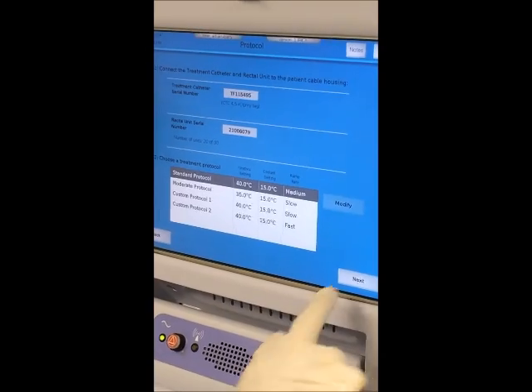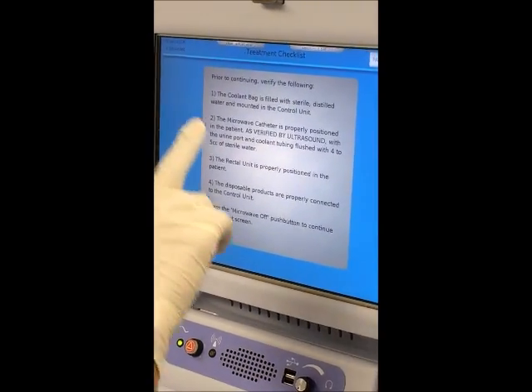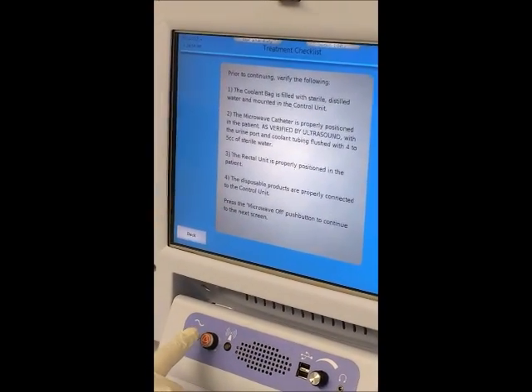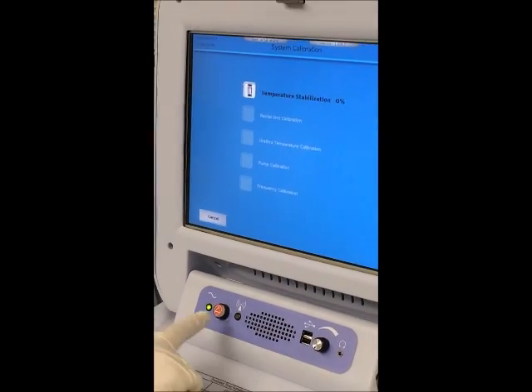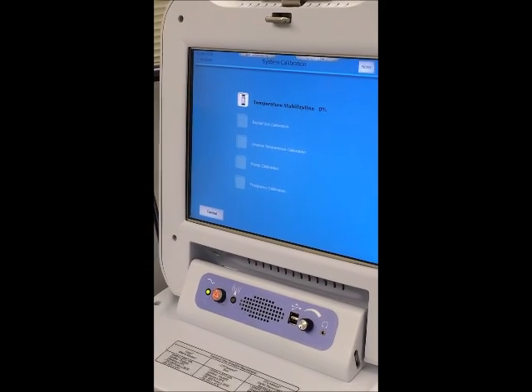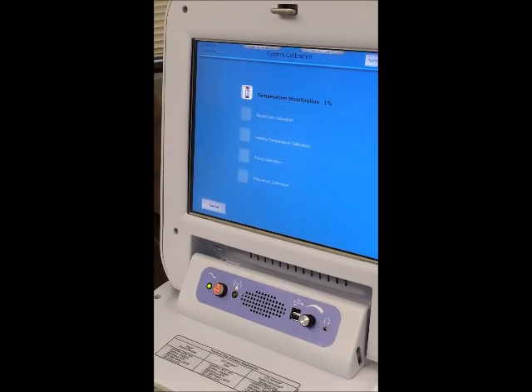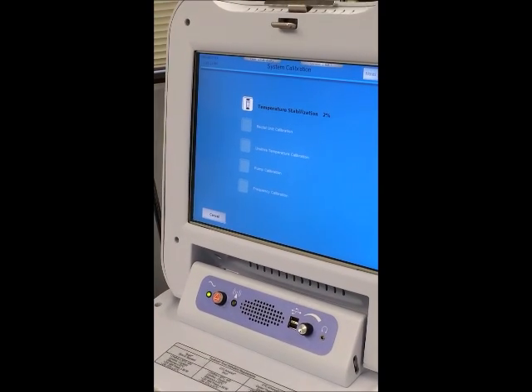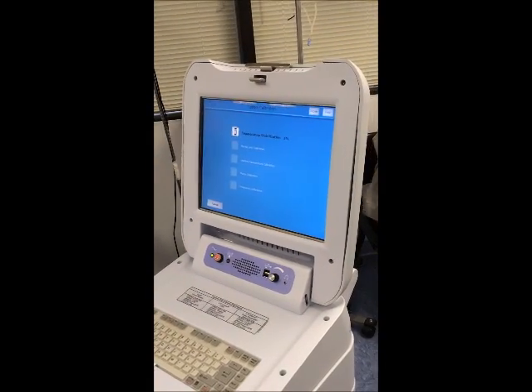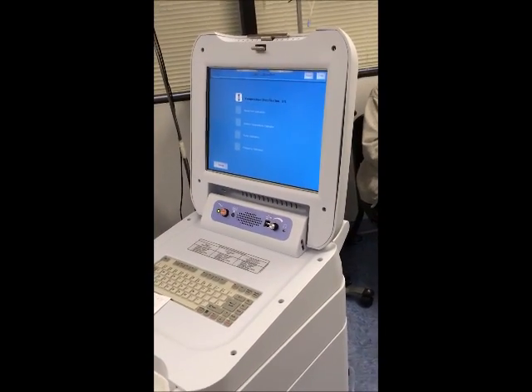We click through and hit next. It asks us to confirm a checklist, and we press the on button. Once pressed, it stabilizes — first temperature stabilization, then rectal unit calibration. It's a very safe treatment option. We had already given one sublingual levsin an hour before; now we give the second sublingual to prevent bladder spasms. Then temperature calibration is done.